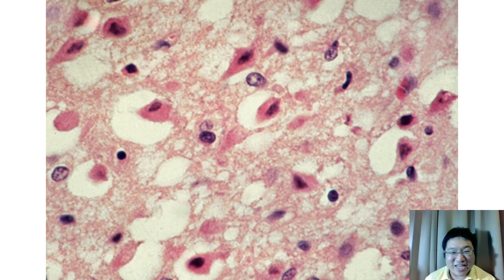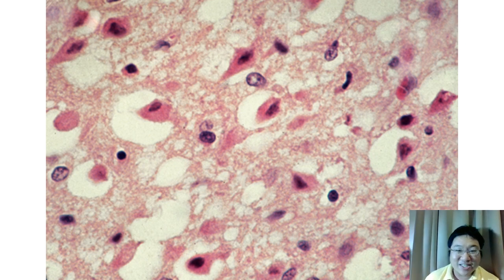Yeah, so what do you see from this image? What change do you see on this image? Do you see these cells? Yeah, they are so red. So what are the changes that we can observe in these cells? These cells are neurons. And what can we observe in these cells?